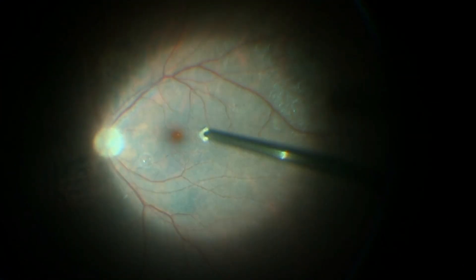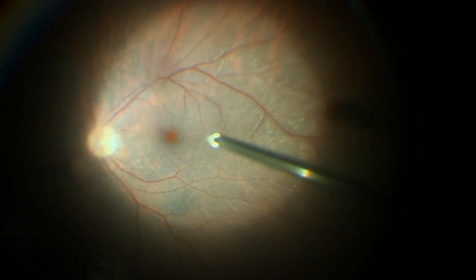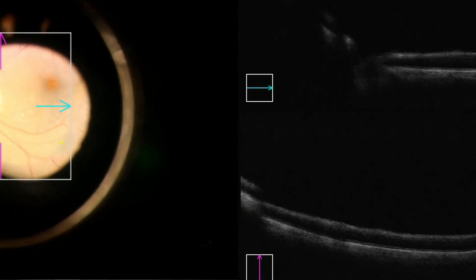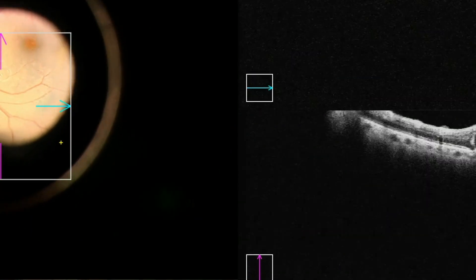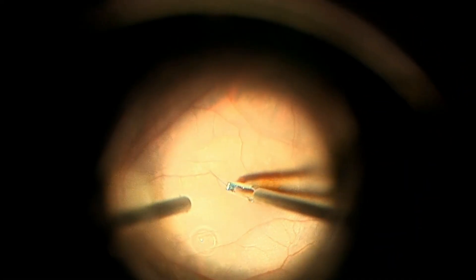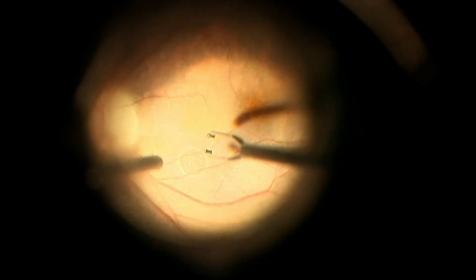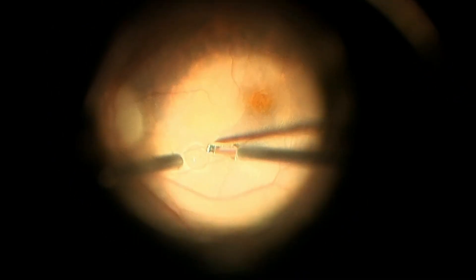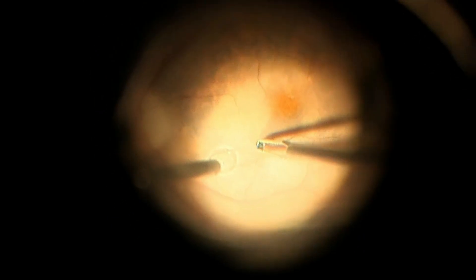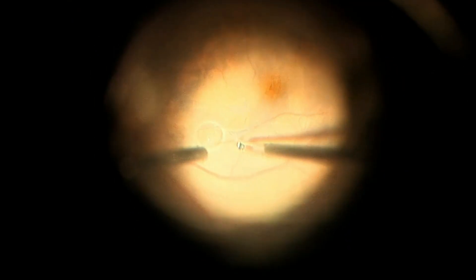I like what the surgeon did here, rinsing out the bubbles that are in the anterior chamber — that's really important. I'll do that a couple of times through the case. I also do a lot of air-fluid exchanges, because I've seen patients who are really bothered by residual bubbles even if they're very small. And we can see the bubble here — that's supranasal macula. It looks like they're peeling ILM. Nice use of intraoperative OCT, just showing that PFO bubble's location for localization.